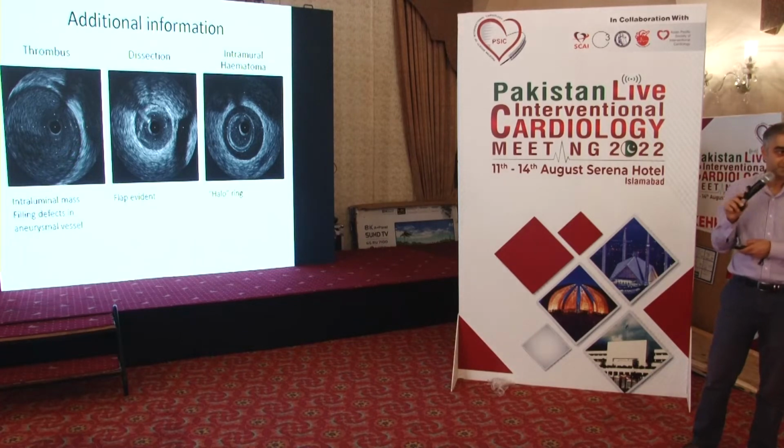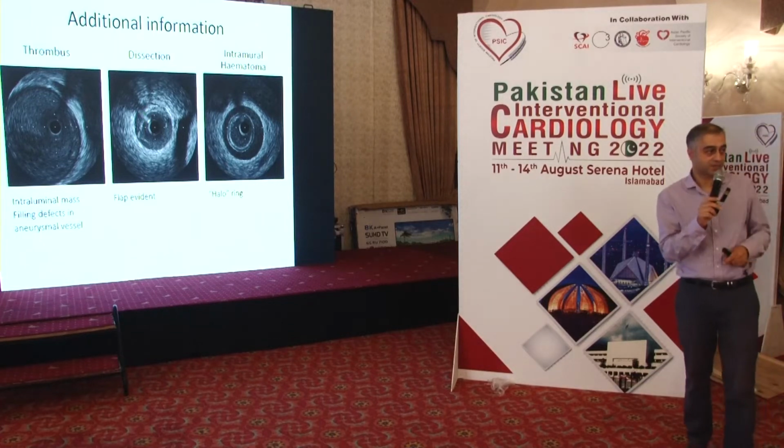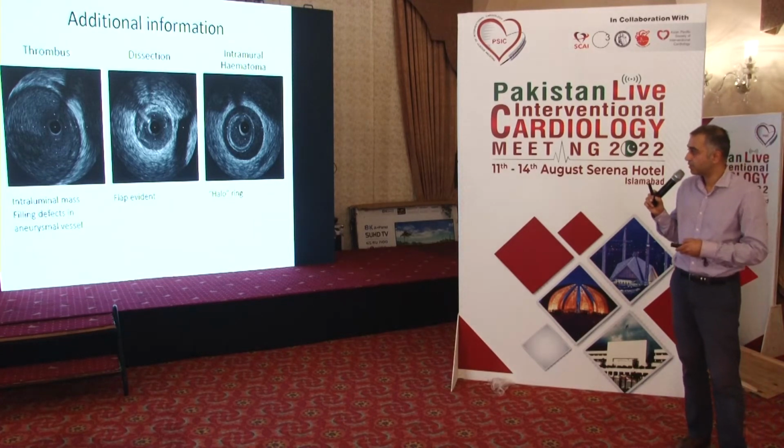That's the media. In the middle one, it's a bit more tricky to see, but it's here, just going around. And then this is plaque inside the vessel. So anything inside the media then is the intima. Intima isn't picked up on IVUS because the resolution of IVUS is not high enough. But anything you can surmise is inside of that is your plaque.